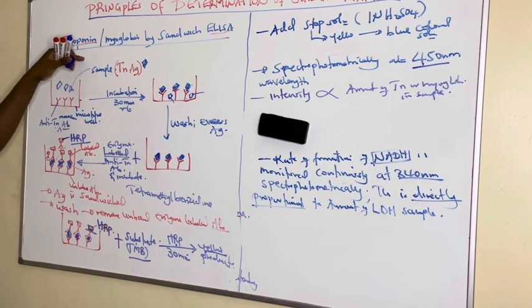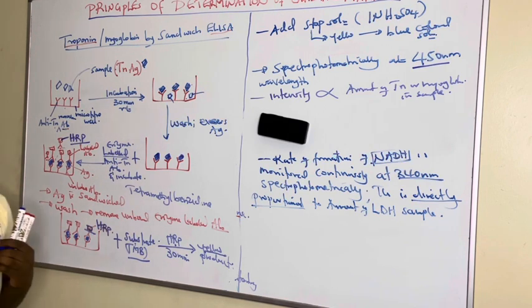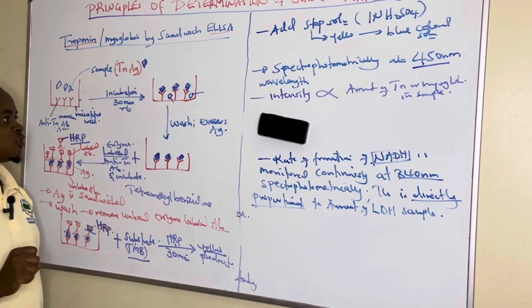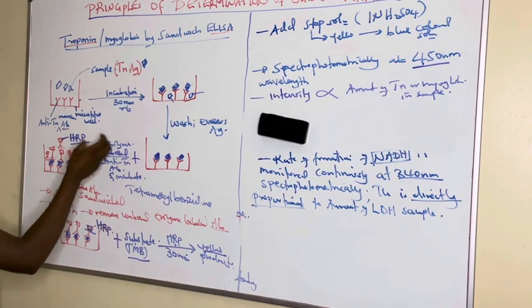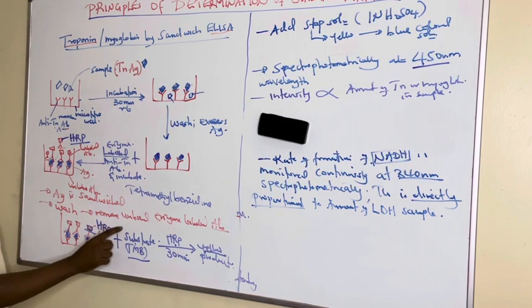If we are looking for troponin, we always put troponin. If we are using myoglobin, we say myoglobin antibody, or myoglobin antigen. So we use specific antibodies, but the procedure is the same, whereby we have a pre-coated microtiter well. We add a sample containing antigens which bind to the paratopes. Then we wash to remove the excess. After washing, we add the enzyme-linked antibody and we incubate. During incubation, they react and sandwich the antigen in between. Then it is followed by washing to remove the unbound.